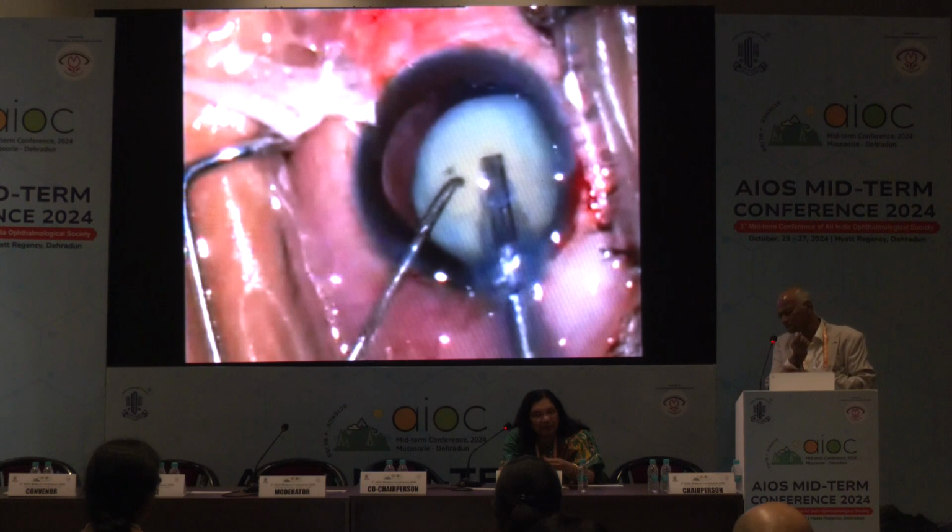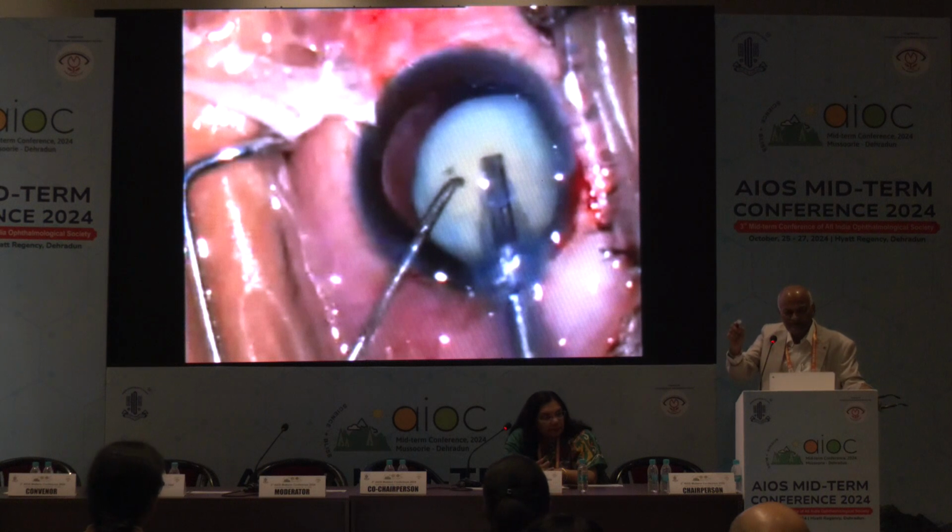Actually the phaco tip should be able to hold the nucleus to itself, which is not happening here. Basically, our tip should penetrate inside the nucleus.